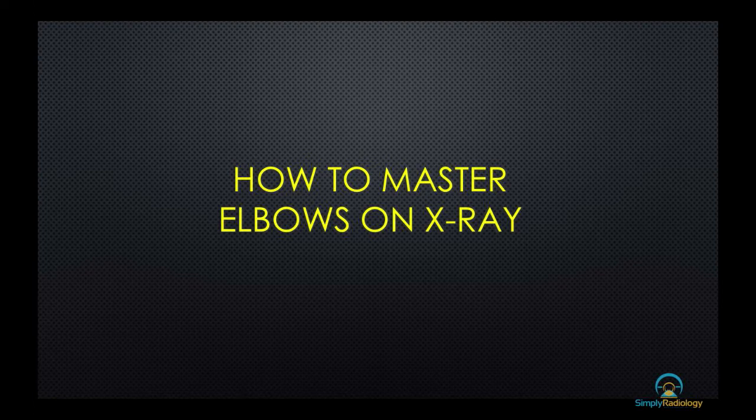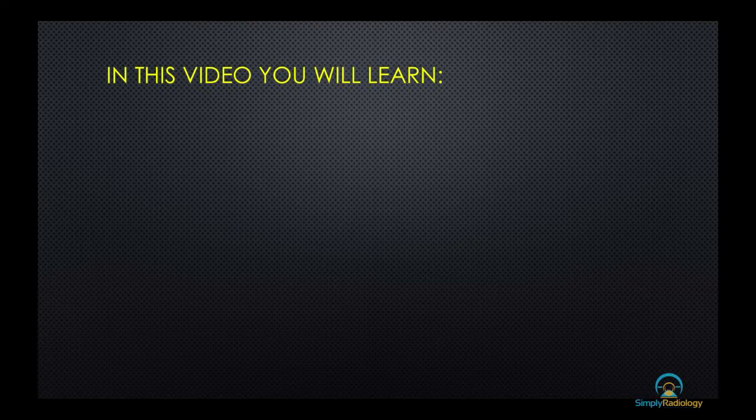In this video, I want to teach you the most important stuff you have to know about the elbow joint. So let's get started.